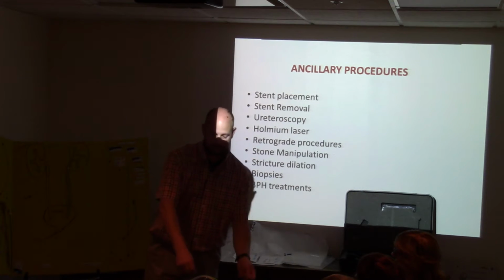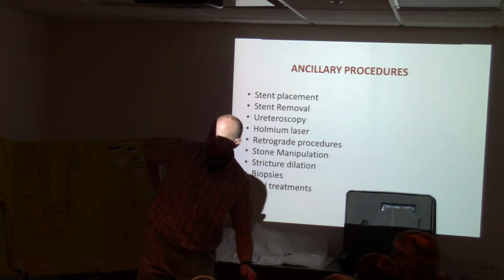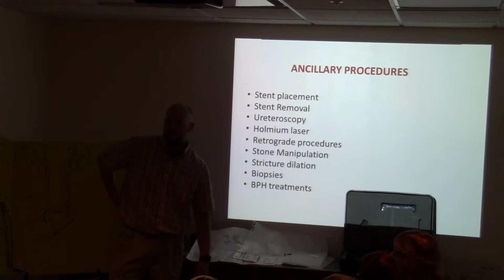But then you'll have a big tube in your back because you'll have a drainage tube to drain your urine until your urinary tract clears. And sometimes they could clear it from the top, going down, get the stones out, kind of meet in the middle. So you'll have a cystoscopy and a perc.